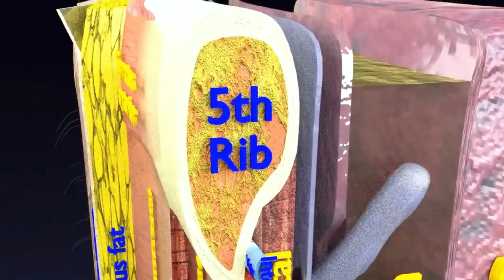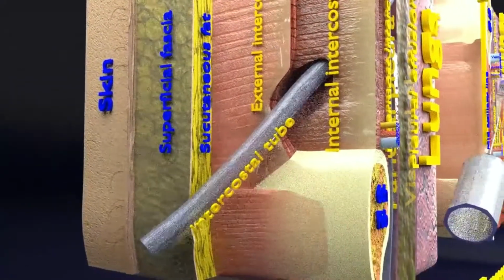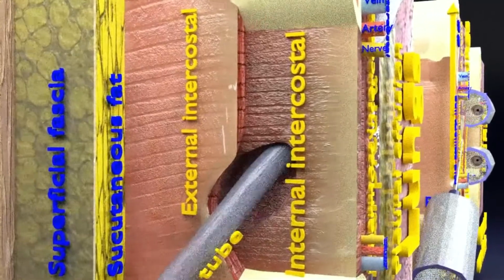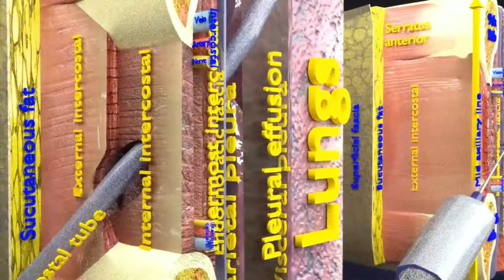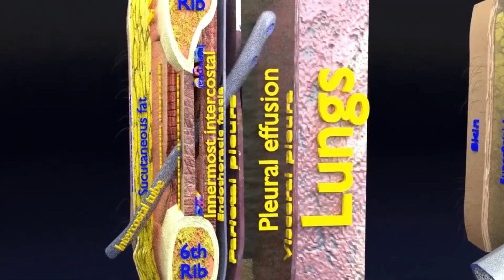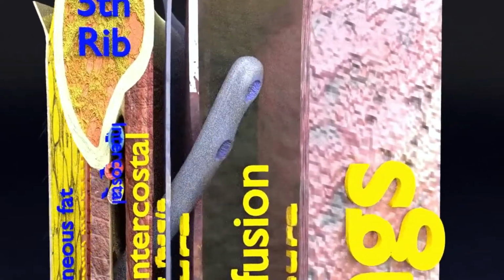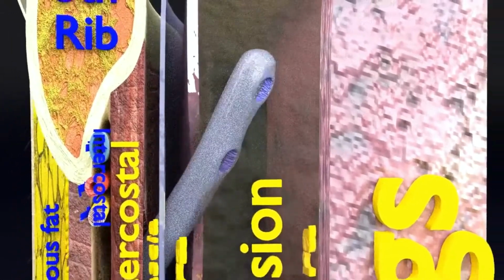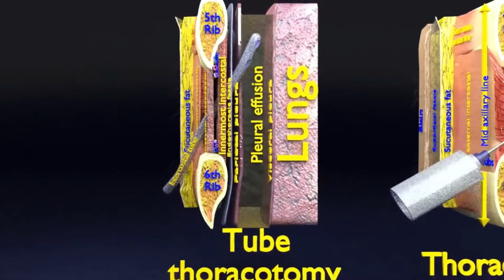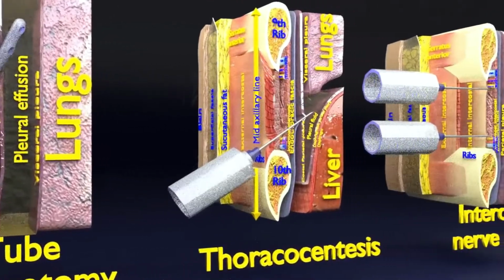As visible in this part of the clip, the model shows a tube which has been inserted into the intercostal space. Commonly, it is inserted into the fifth intercostal space, slightly into the mid-axillary line, but it may be inserted into the sixth space in case of hemothorax or empyema, or it may be upward in the fourth space in pneumothorax. At these points, muscle bulk is less, so it is easy to pass the intercostal tube.